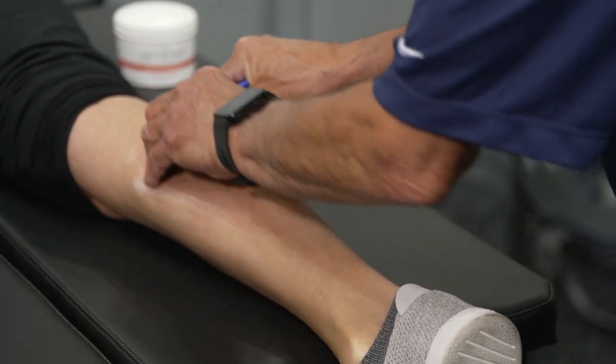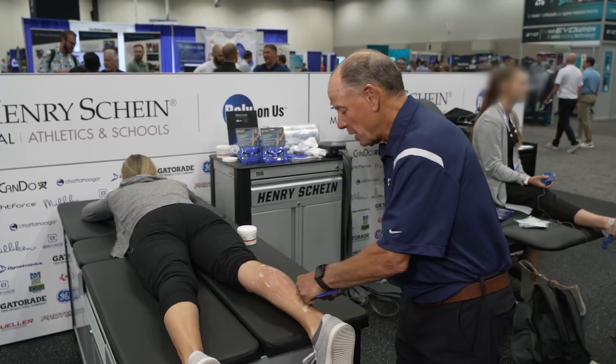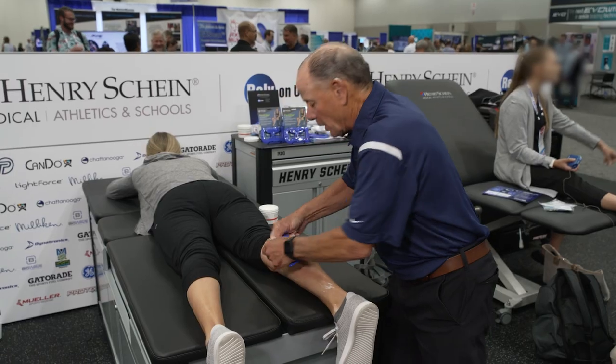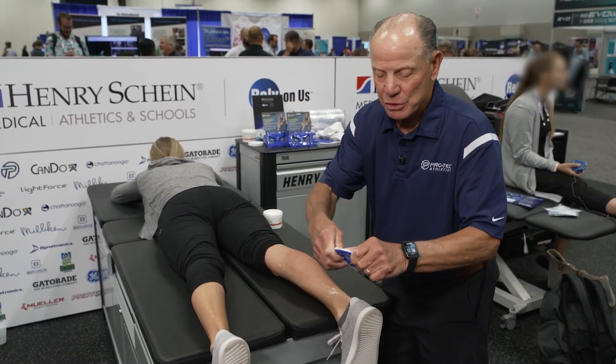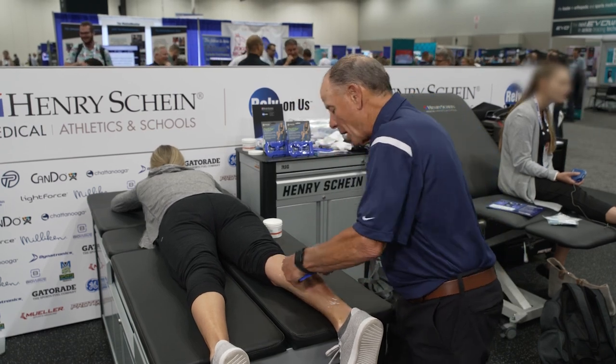I could also use a radius edge to do a stroking technique. I'm going to take my hands like this and strip the tissue in this fashion. I'm using the lateral part of my fingers to guide and direct FlexEdge so it doesn't wander sideways.